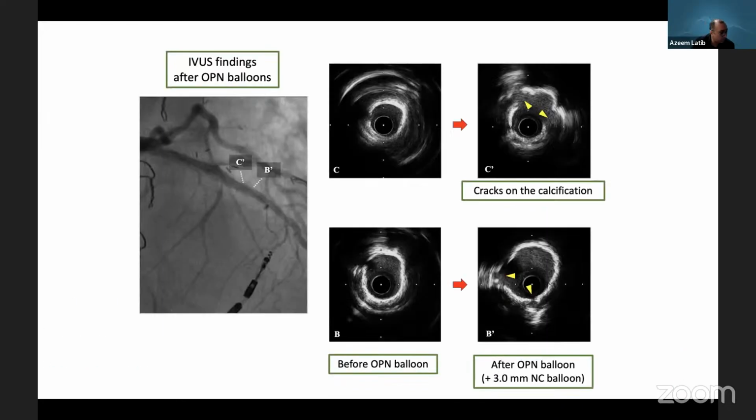It's a very impressive picture, the one on top, because when you look at how small that vessel was, that's very impressive. So maybe, Antonio, just a last question before we let you go. When are you using OPNs in your practice? Okay, I use OPN, especially, so the crossability of OPN is not excellent. It's difficult to cross a very tight lesion with the OPN as a first intention.